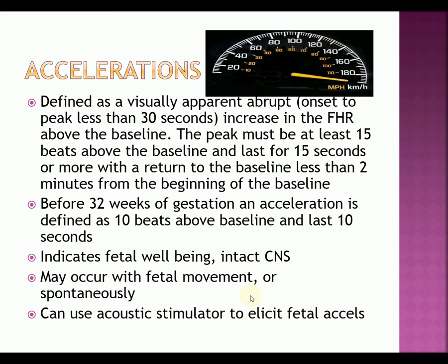So it's got to last at least 15 seconds, and it's got to be at least 15 beats above the baseline to be considered an acceleration. If it lasts for more than 2 minutes, it's considered a prolonged acceleration. If it lasts for more than 10 minutes, it's considered a change in the baseline to tachycardia. For preterms before 32 weeks gestation, an acceleration is 10 beats above the baseline and lasts 10 seconds.